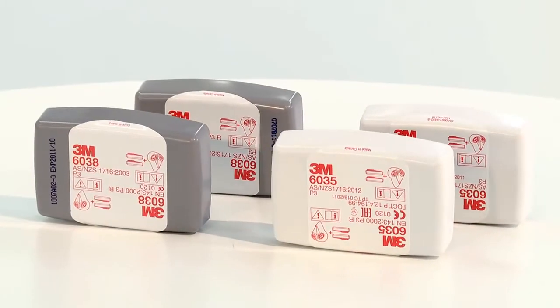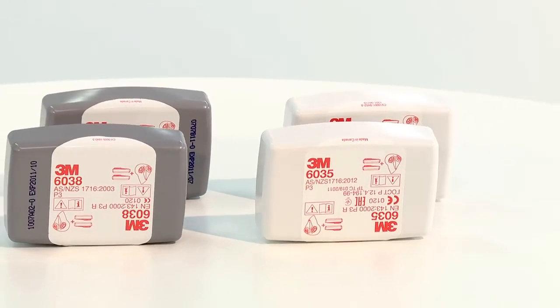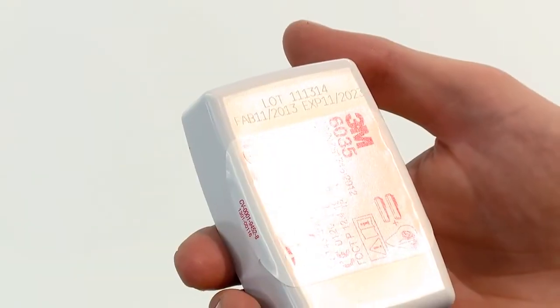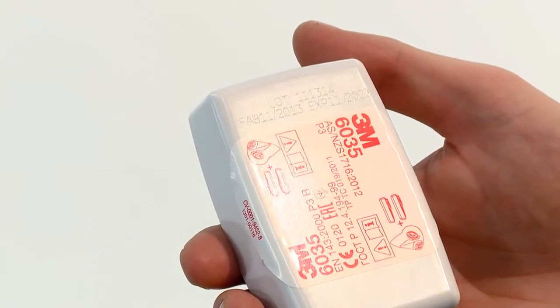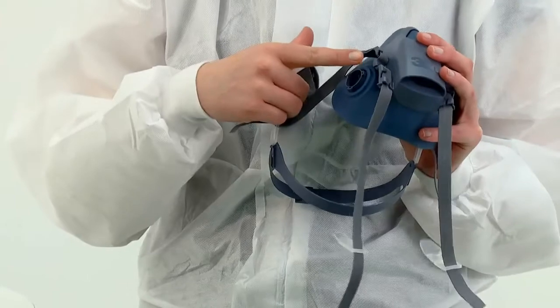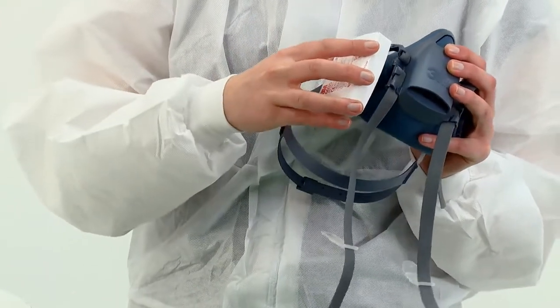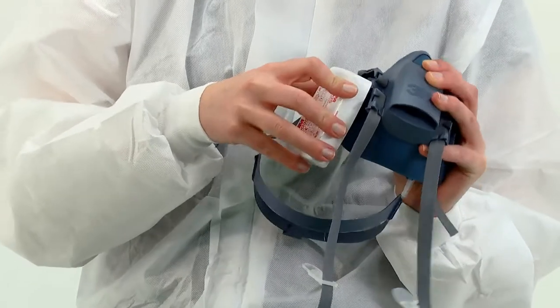Firstly we demonstrate the fitting of encapsulated 6035 and 6038 series particulate filters. Before fitting, check that the filters are within their use by date. Align the line on the inside of the filter to the arrow on the mask and secure in place with a quarter turn clockwise. You should feel the filters lock into place.